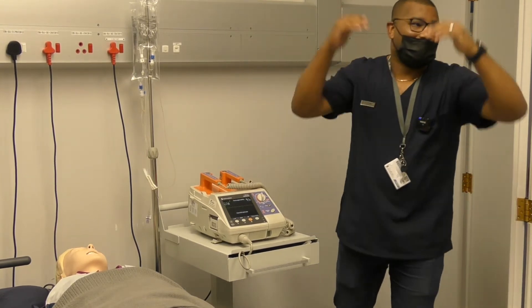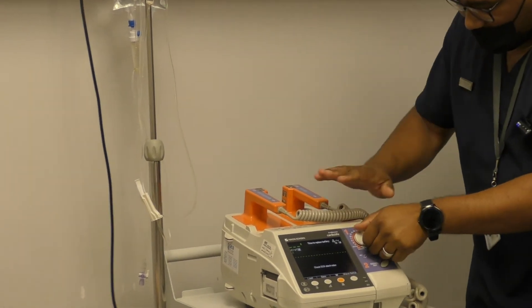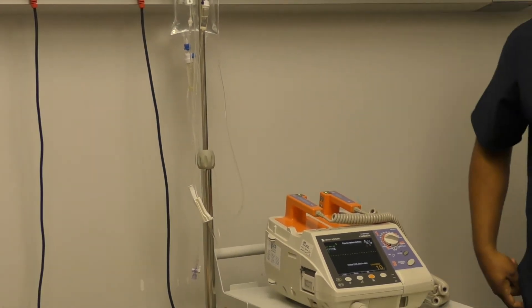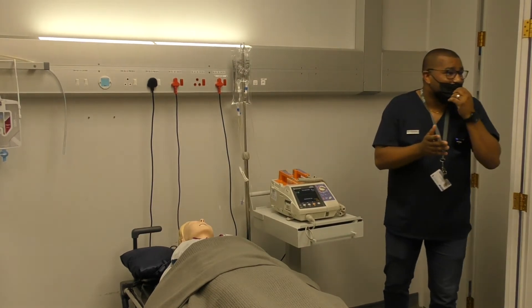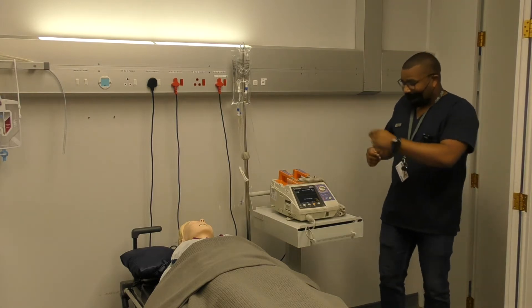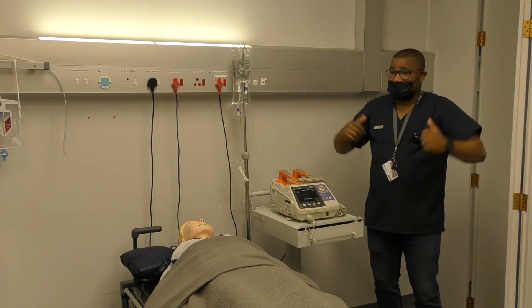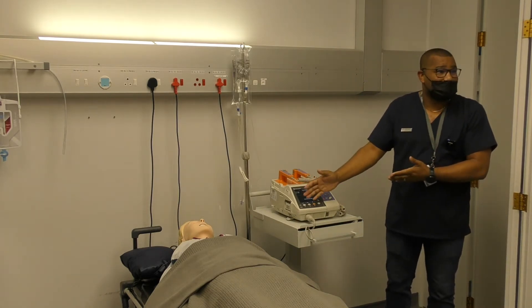Let's say I put it on 10 joules, for example, and I want to make sure those joules I'm going to give are 10 joules. Now I charge the machine — if you listen, you can hear it charging. It's important to recognize when it is fully charged. It's similar to building up emotions before exams — you need to discharge. You will hear this charging sound, and the machine has a built-in default where after 40 seconds it automatically disarms.